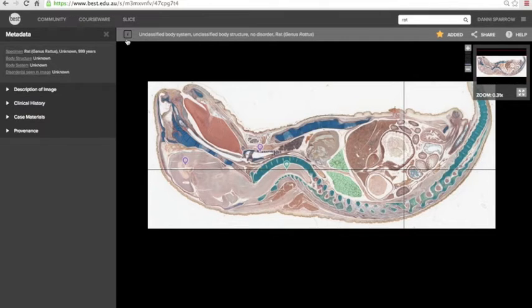As I mentioned, there are 3 common ways of using Slice in class. The next couple of webinars are going to focus on case studies presented by academics running Slice-based activities in class. Today, though, we're going to focus on using Slice images as part of an interactive drag and drop question on the Smart Sparrow Adaptive e-learning platform. So I'll pass back to Danny to cover this.